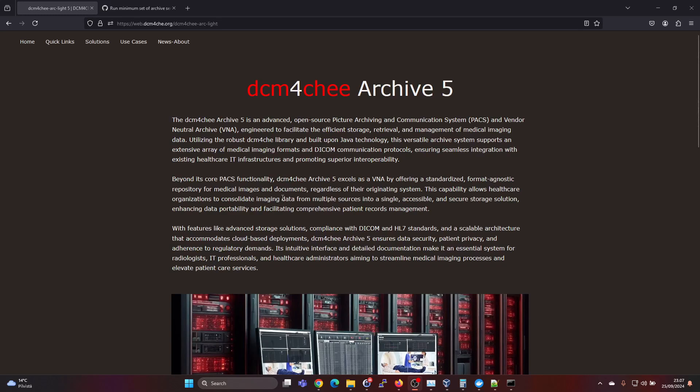Hey guys, in this video I'm going to show you how to install the dcm4chee Archive 5 VNA or PACS on a Windows environment, on Windows 11 using Docker Desktop.